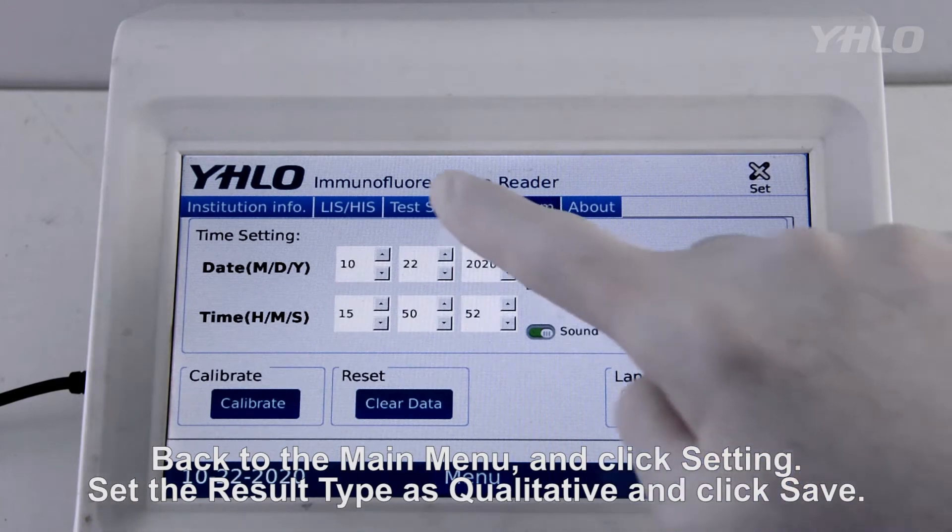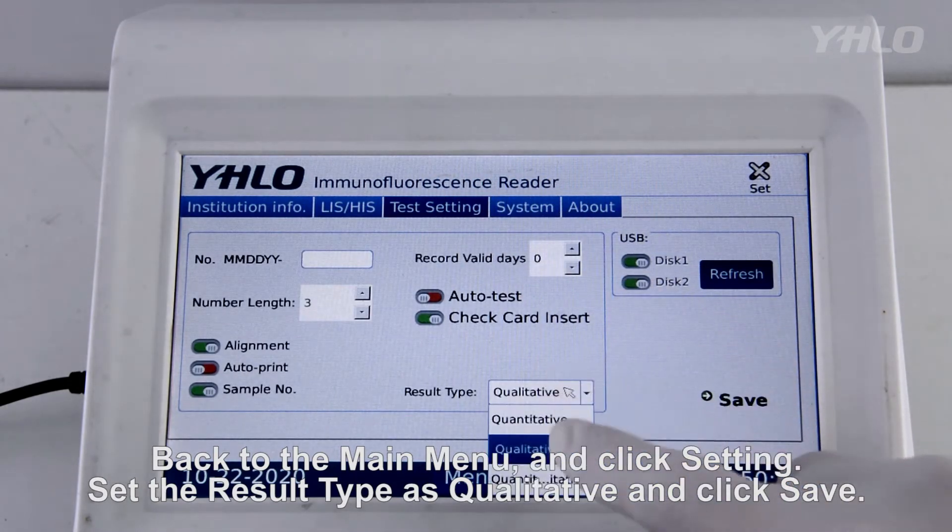Back to the main menu and click Setting. Set the result type as qualitative and click Save.